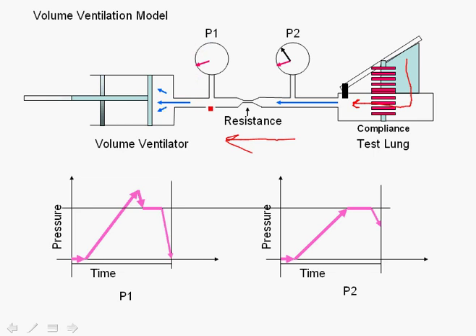Effectively, the ventilator just allows the gas to go into the atmosphere, so our mouth pressures are basically 0. P2, we still have to have that pressure gradient because we're going to have flow now from the alveoli, from our P2 towards P1 to overcome this resistance. So now that there's flow, we need a pressure gradient, and we can see that here. We can see that there's some pressure still in P2, our alveolar pressures, and there's really no pressure in P1 because that's just our atmospheric pressure.